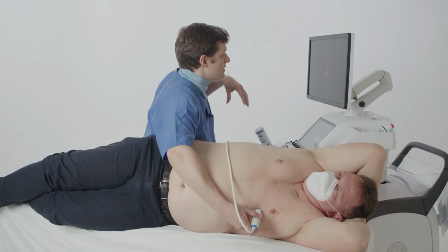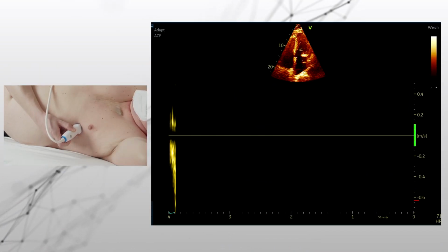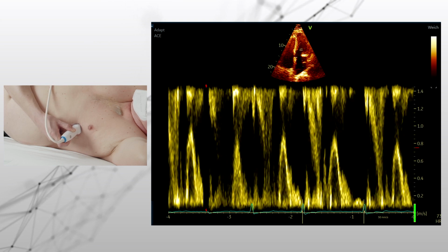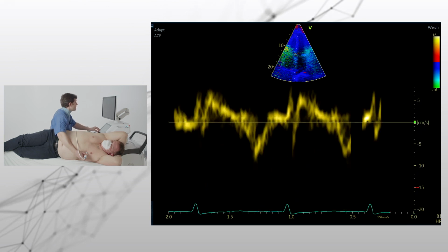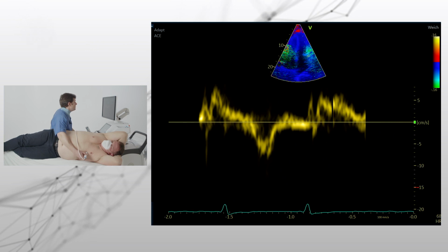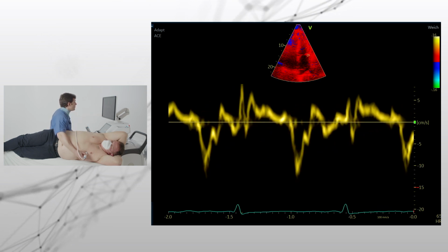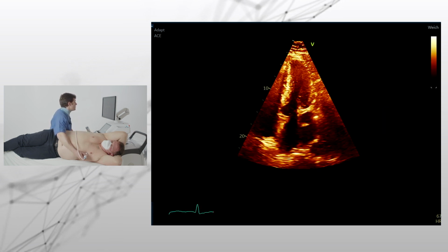The one thing that is still open is one thing you can sometimes easily forget: diastolic dysfunction. We also want to see it in this case, and we have the E wave we have to measure. And of course we need to use the tissue Doppler, not only for the right ventricle, but also for the left ventricle. Here we have the E' medially and the E' laterally. And you also hear that's a nice tissue Doppler signal, and you should always have more than one signal to compare, in atrial fibrillation the average signal overall.